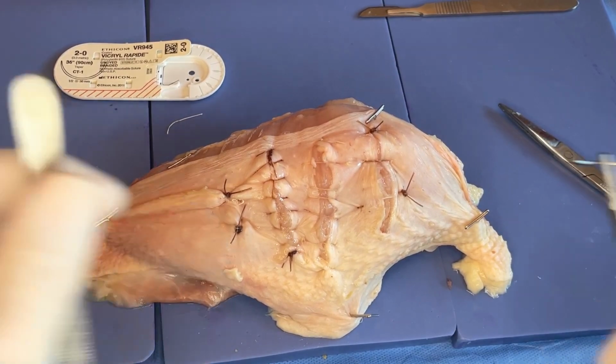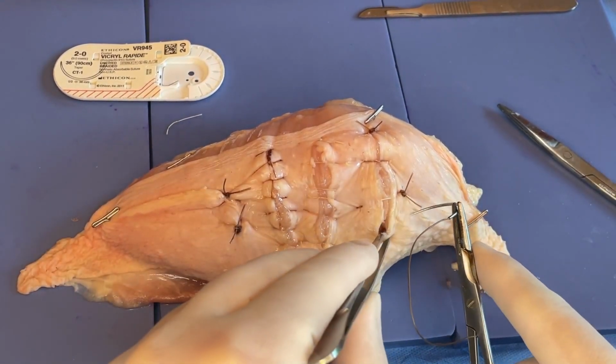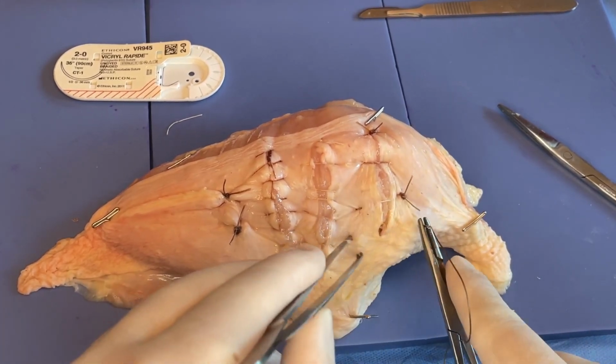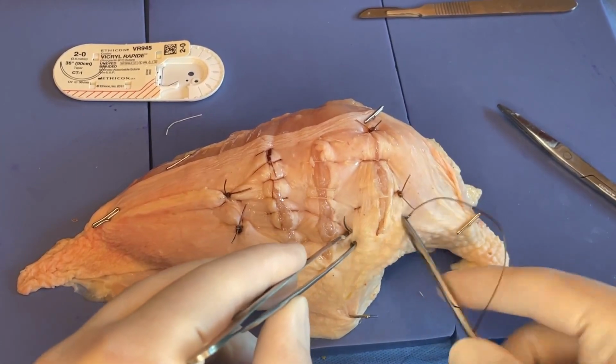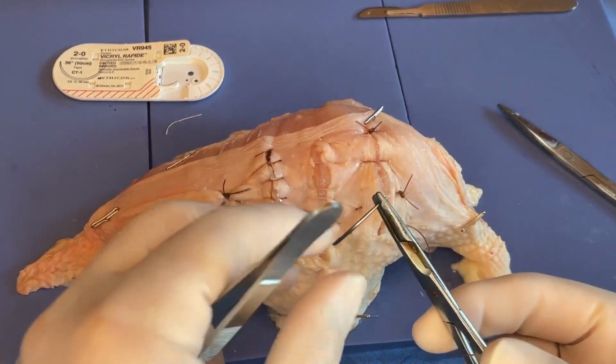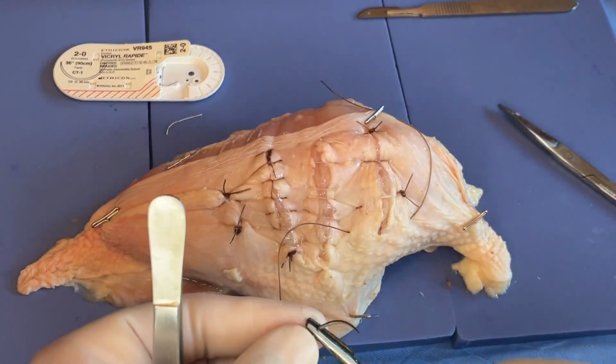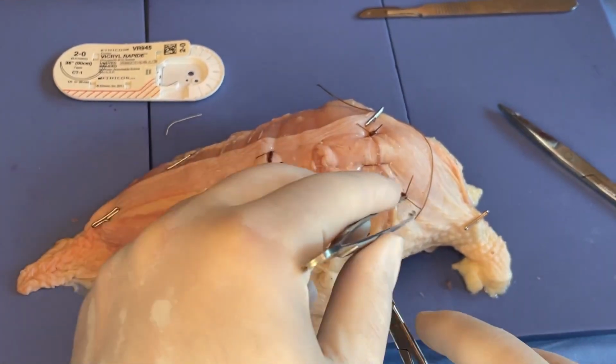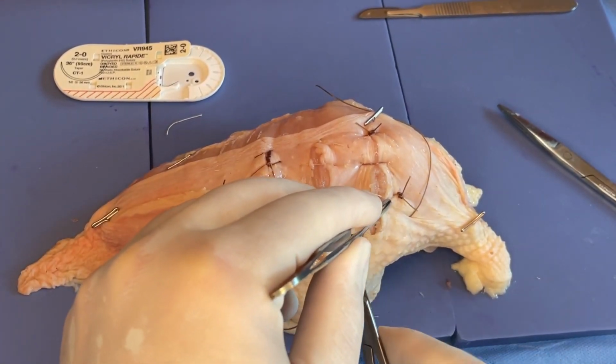One of the ways that some people describe this is to say you're going far, so far away from the defect here, and coming out far away, so it's far, far, and then as we flip this around, now we're coming near, near.